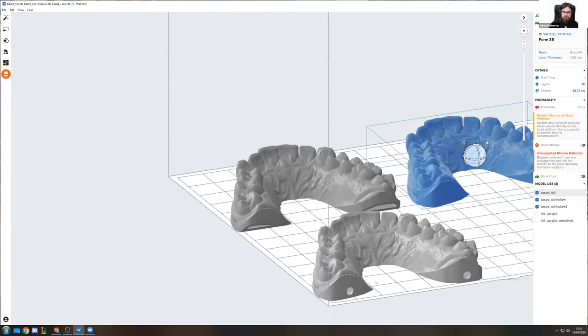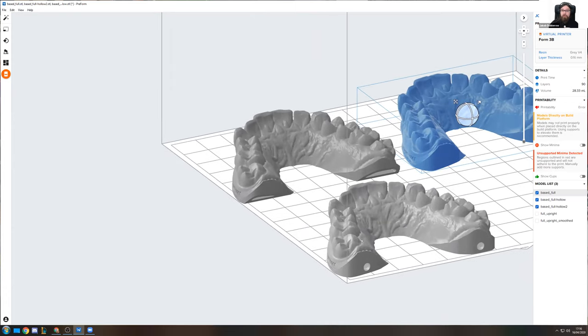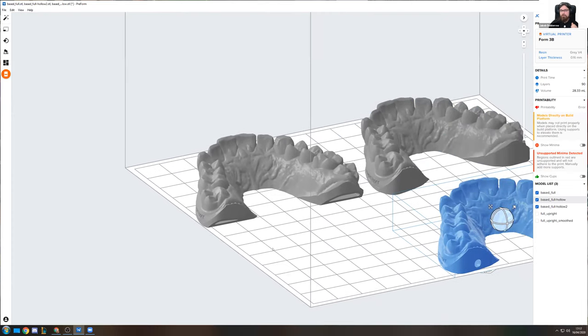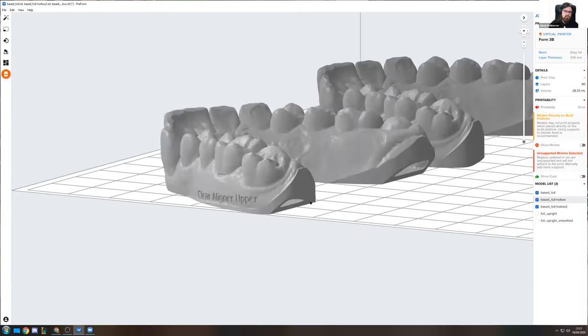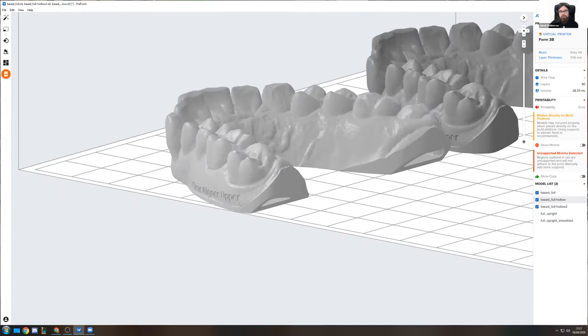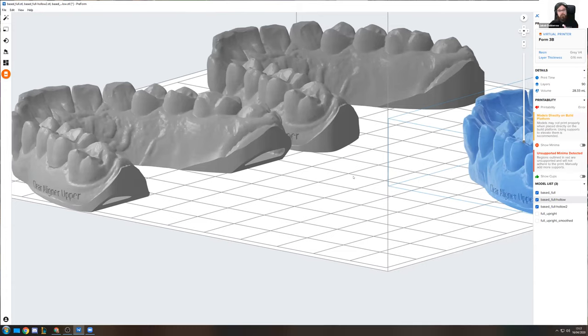Technically you only need one hole. I like to do two just for venting reasons when you wash the whole model out at the end. So you can either put in a hole or two at the back of your model where it's not really visible, or what you can also do, and this is a bit of a combination of two things, a lot of people like to do a planar cut at the end at a roughly 45 degree angle, just to get in there with a spatula and make it easier to take your models off. You can also use this as a venting hole for the model itself. So you have a two-in-one, and you don't need to cut in any holes. You just cut it off planar at the back and then it's open at the same time while being able to take it off the build platform.